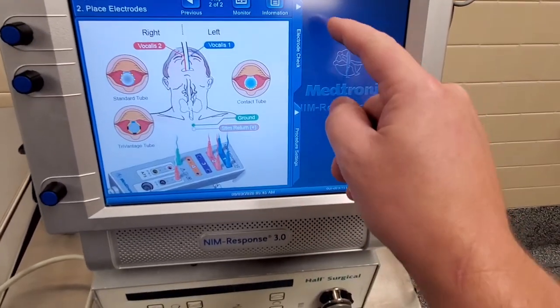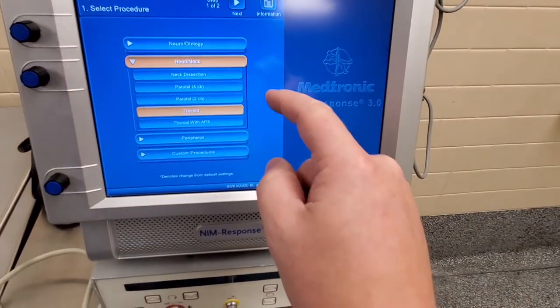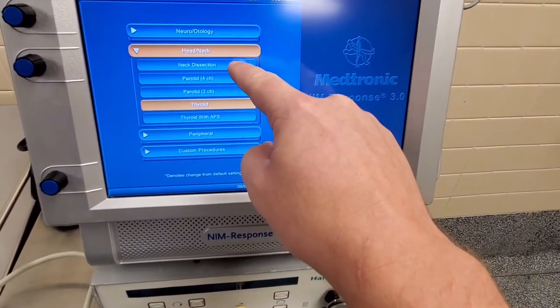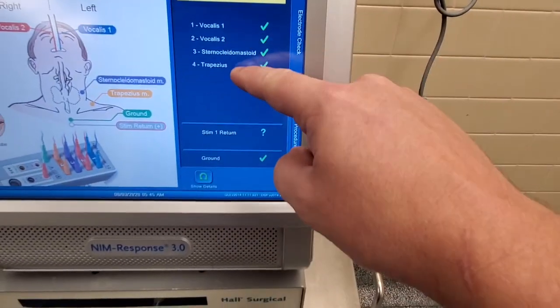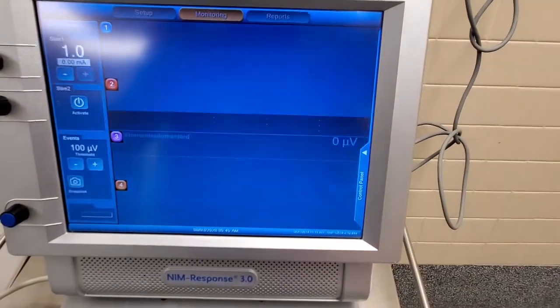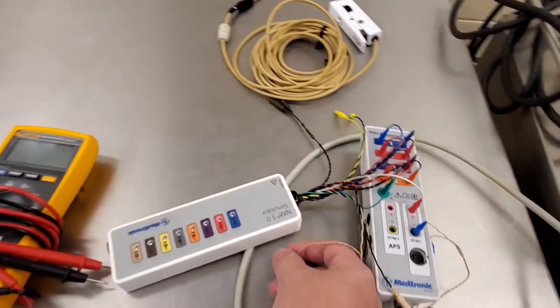You should have two to eight channels depending on the procedure that you have selected. So here you can see the procedures. There's a lot of settings. We don't need to know what they are. We just have to know how to go in. You can see here we have four channels on this procedure.